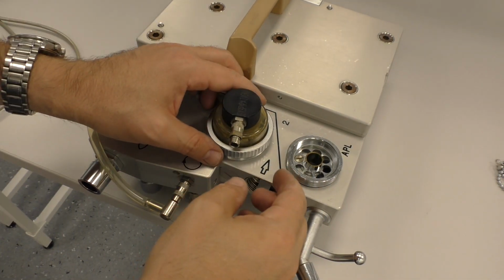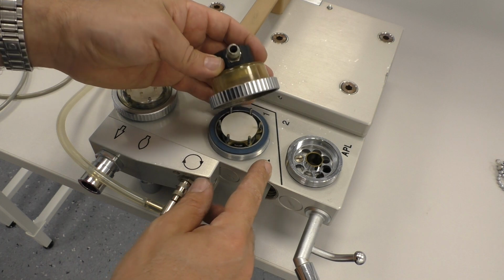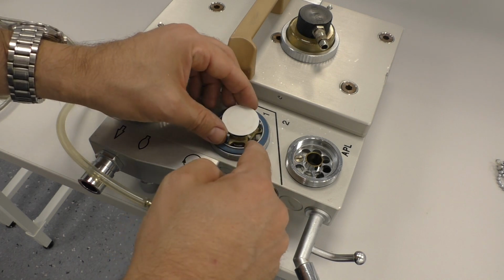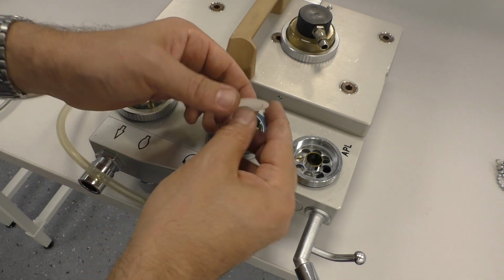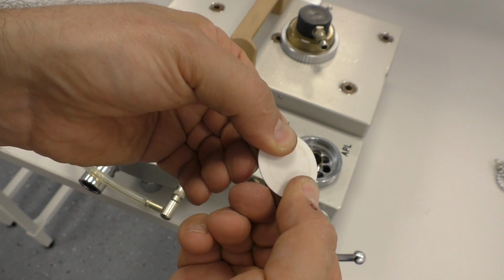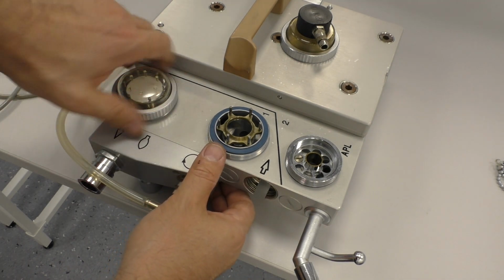Another interesting detail is on the upper side of this filter unit here. This is the inlet and the outlet that go to, I don't know, the patient or wherever. If you unscrew this, you see this very thin ceramic disc here, which is a valve that closes when air or whatever gas we have wants to go that way, and it opens up when the air comes up through that hole. It is about, I don't know, a couple of tenths of millimeters. It's extremely light. It's ceramic, and it's certainly, oh, it's incredibly strong. Yeah, it breaks. So it's clearly a ceramic material, very light, has to move in the airflow.